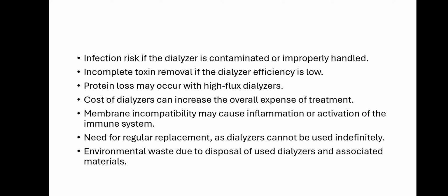Next, protein loss may occur with high flux dialyzers. The cost of dialyzers can increase the overall expense of treatment. Membrane incompatibility may cause inflammation or activation of the immune system. There is a need for regular replacement, as dialyzers cannot be used indefinitely. There is also environmental waste due to disposal of used dialyzers and associated materials.